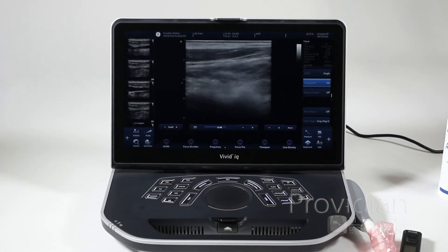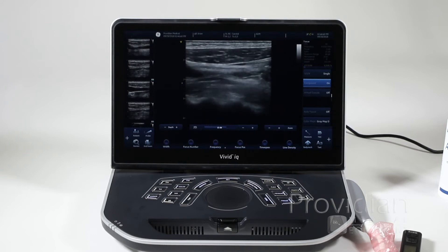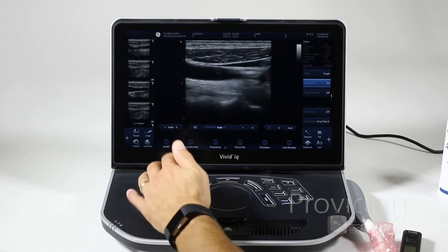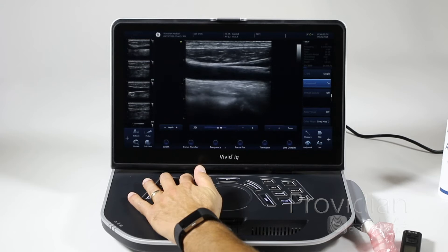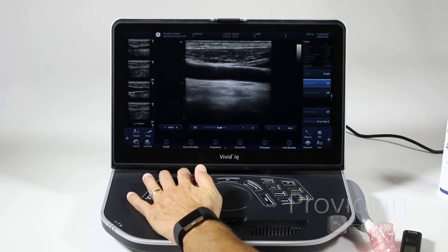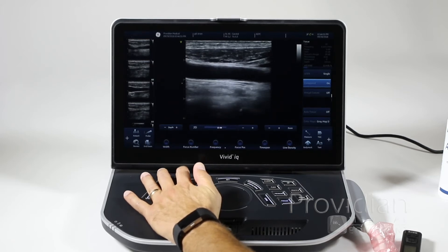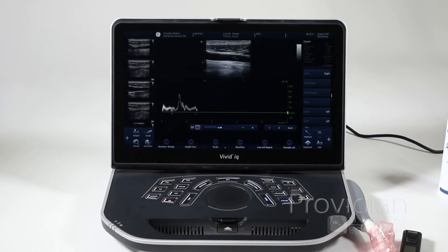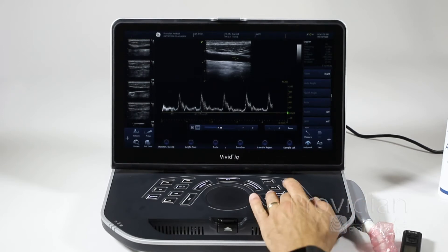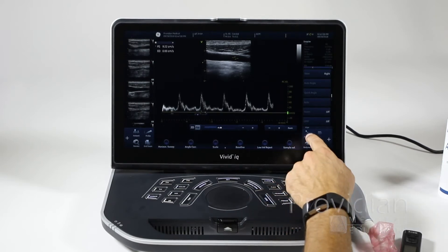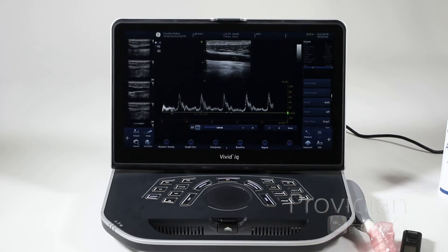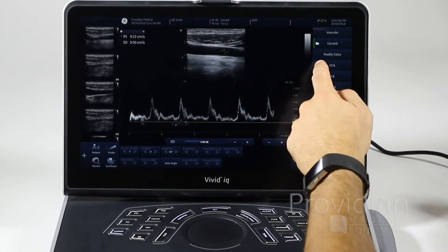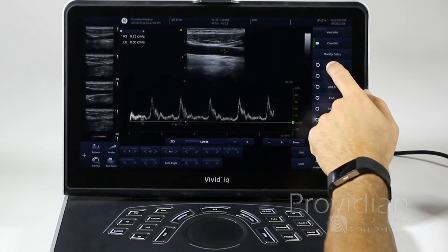Now to take measurements in PW Doppler — just to show you how the Doppler modes work. There's a whole video on using Doppler, but right now we'll just show you how the calcs work. You can go ahead and hit PW and freeze, then click measure. It automatically went there, and we just do CCA.